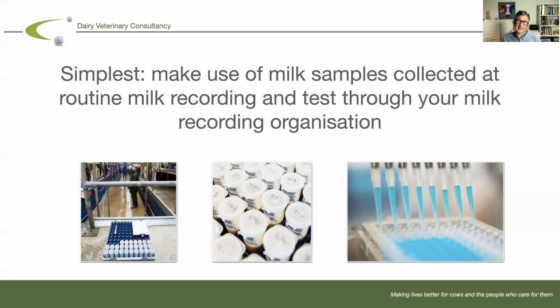I say it's less likely than mixing up of sample pots or identification, simply because even when you have very high PAG levels in a very established pregnancy, you need in the region of 10% of the milk to be contaminating that non-pregnant sample, more than just a drop or so. But be aware of it and please be careful in how you're taking your milk samples.